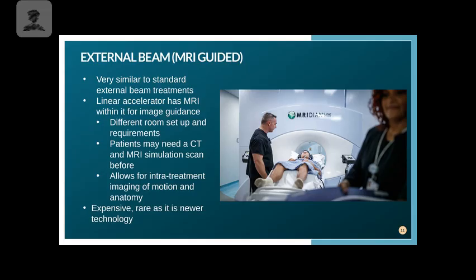One thing that's really nice about this, though, is that we can get an MRI during our scan. So, with our photon beam, we can't treat with photons and image at the exact same time to monitor a patient's breathing. But in the MRI, you can because the magnetic field is different than using photon energies. So you can shoot photons that are high energy from the linear accelerator to treat the tumor and also use the MRI at the same time to image while you're doing it. So you can see the patient's breathing and the location of the tumor change as you're delivering that dose, which is super cool.